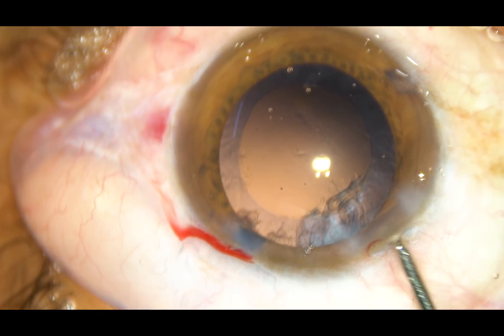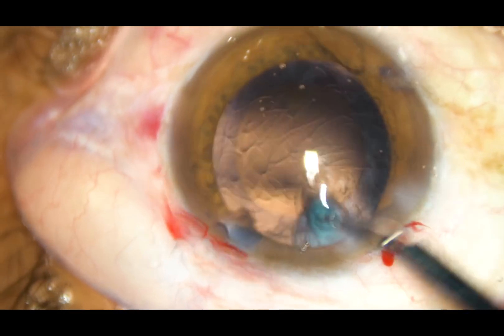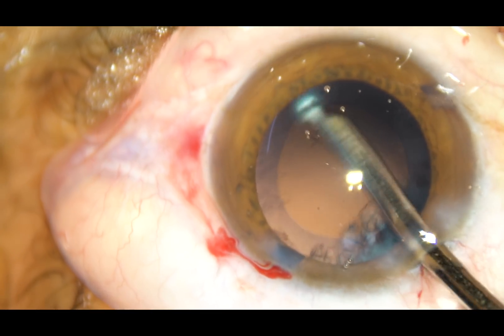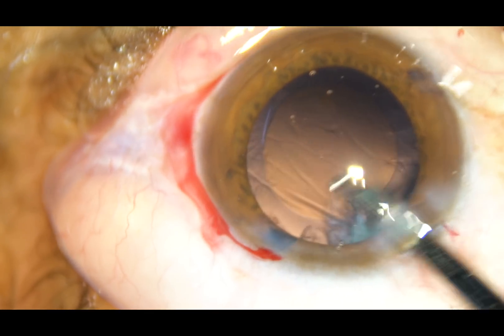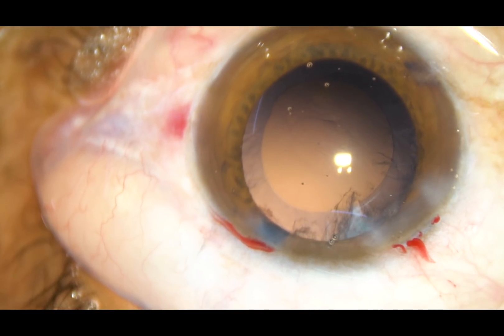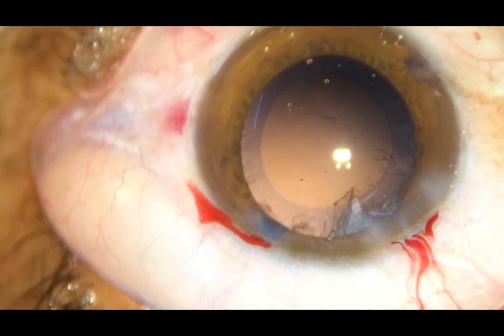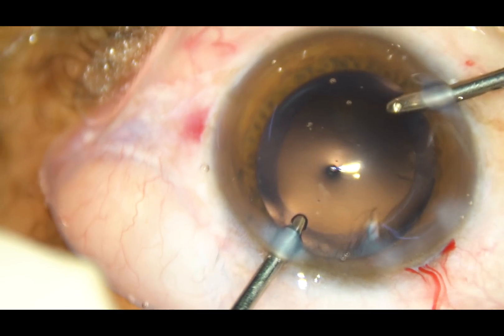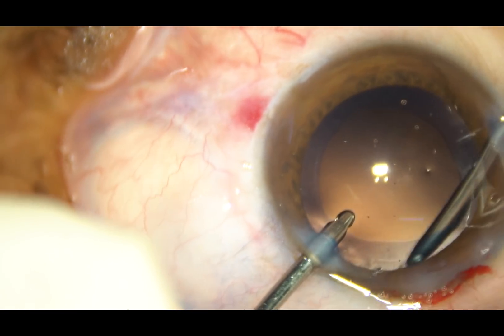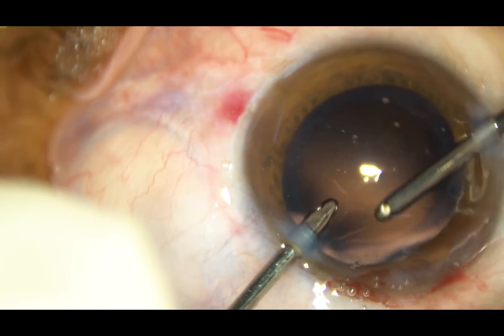After managing the nucleus, the cortex is to be removed. A little bit of viscoelastic is injected. A Simcoe cannula is being used for removal of the cortex which is inferiorly located. In this case, my plan is to use bimanual irrigation-aspiration for removal of the sub-incisional cortical matter. Since the side ports are small, we cannot use a Simcoe cannula. The irrigation is through the left side port and the aspirating probe is aspirating the cortical matter from the sub-incisional area through the right side port.